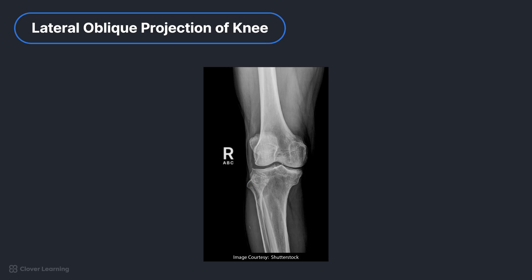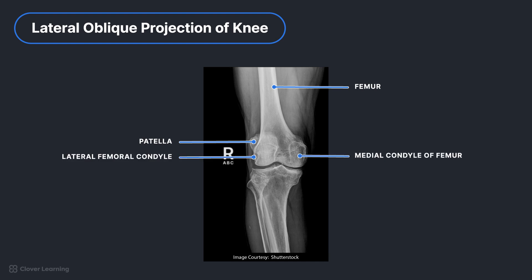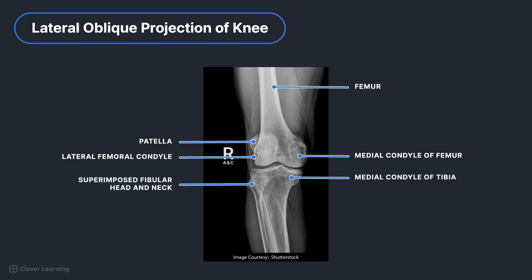Let's identify the anatomy in this image. From superior to inferior, we see the distal femur, patella, lateral femoral condyle, medial femoral condyle, medial condyle of the tibia, superimposed fibular head and neck, and proximal tibia.